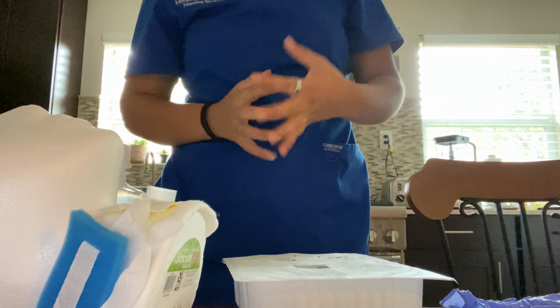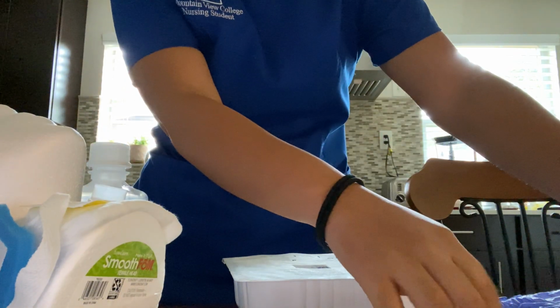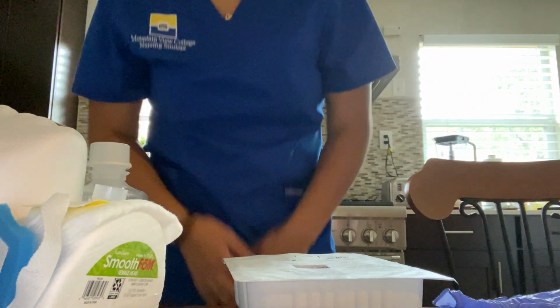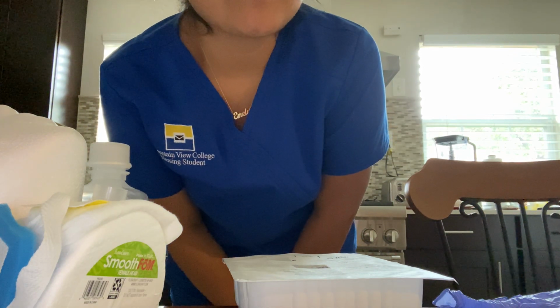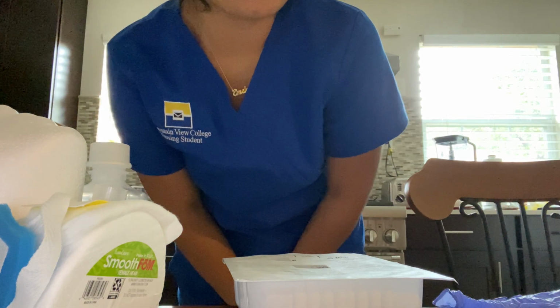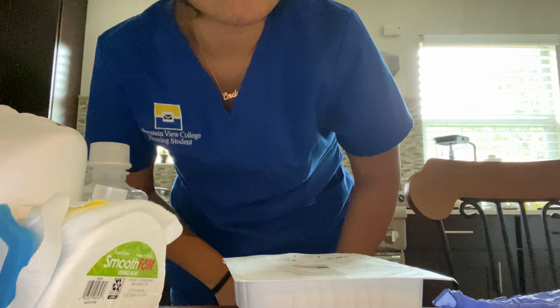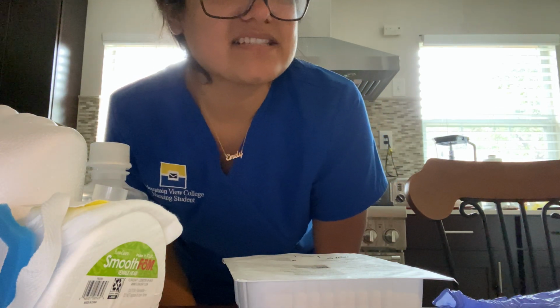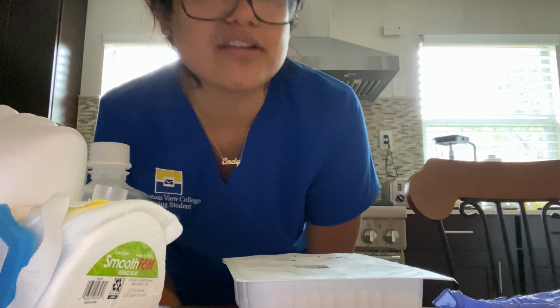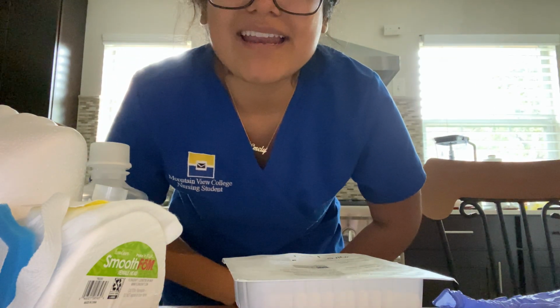Okay, so we're going to start off by verifying and checking the orders. I have them right here. We are going to start by stating the name: Wanda Chi, MRN 8729 2301, date of birth 07/15/19XX. Allergies, no known allergies. Physician's orders: tracheostomy care Tuesday, Thursday, and Saturday, using normal saline at 0800. Suction to bedside and suction tracheostomy PRN at 0800 as well. Signed by the physician. So that's ready. We read the orders, verified it, and we're ready to go.